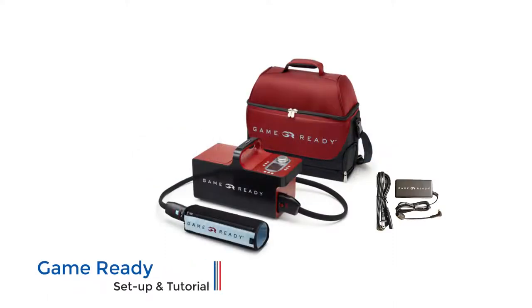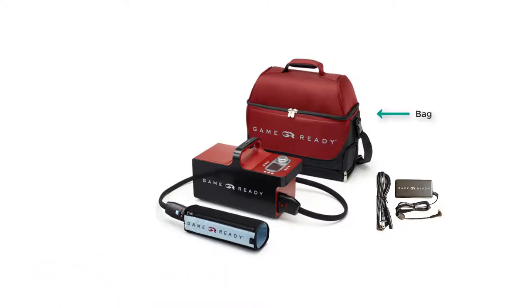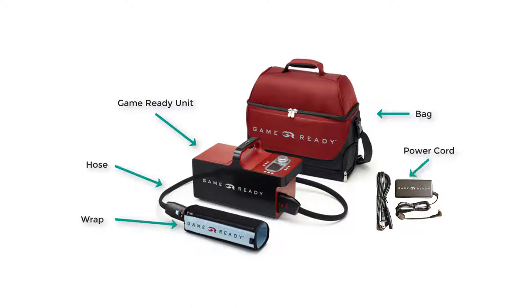When you receive the unit, you should get the following items: the carrying case, the Game Ready unit, the umbilical hose, the wrap specifically for your body, and the power cord.